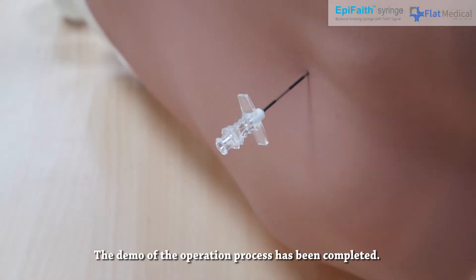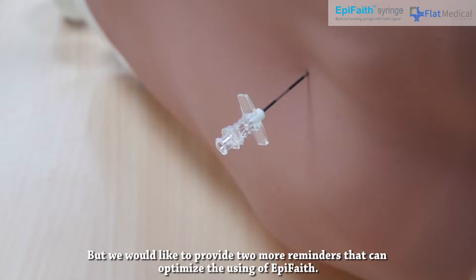The demo of the operation process has been completed, but we would like to provide two more reminders that can optimize the use of EpiFaith.